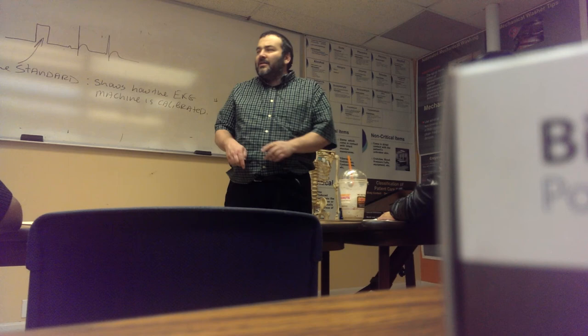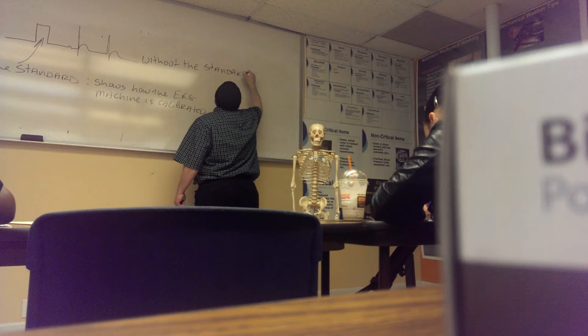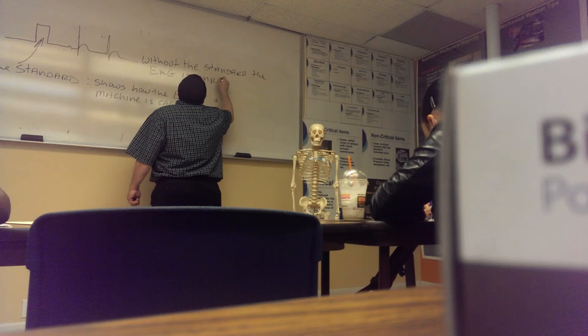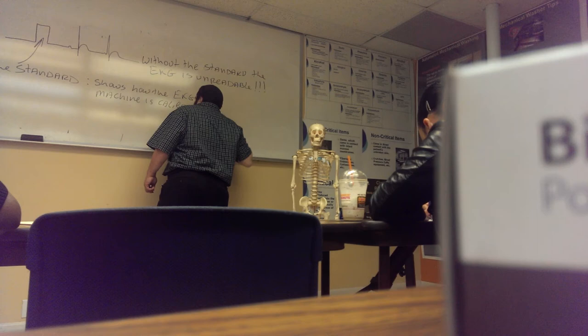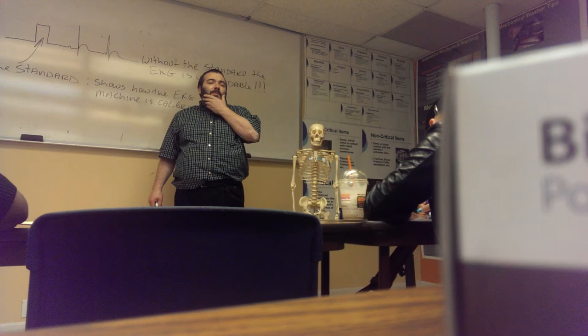Here it is, the sentence that you must remember: Without the standard, the EKG is unreadable! The standard must be there, either in numbers or by this little box right there. And oftentimes you'll see three of them or six of them on the paper, depending on how the machine is set up. But there will be at least one.